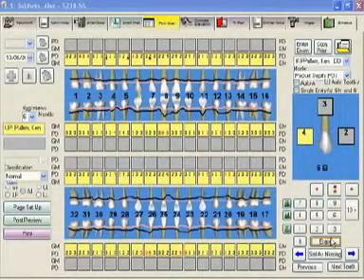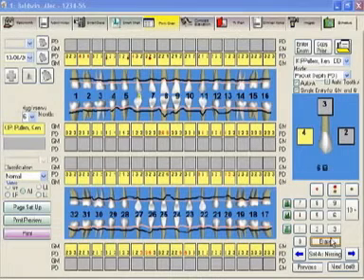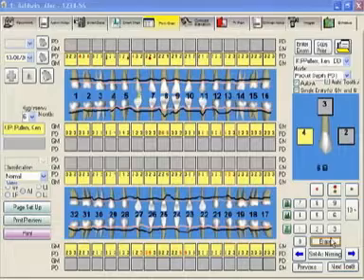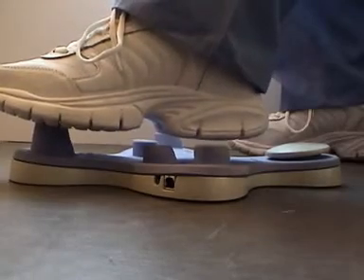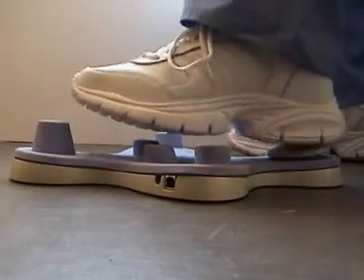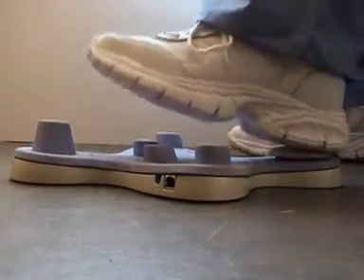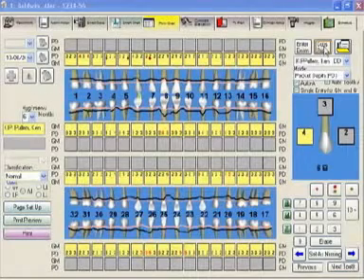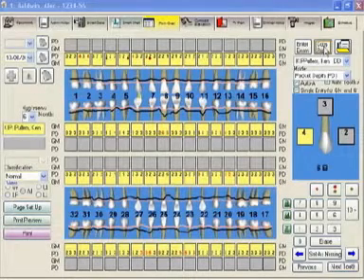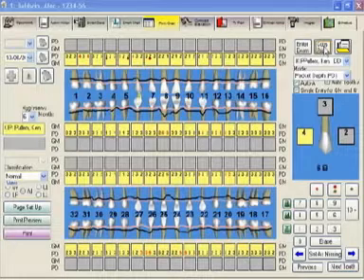I want to show you a fast and easy way to just update the last perio chart with a complete exam. It makes it really nice and easy. When you open your program, you can just mouse up to the copy prior and then you're able to just probe everything just like you would, but only change the ones that have changed. So you're still probing and checking every tooth.